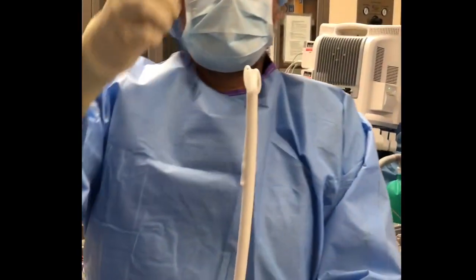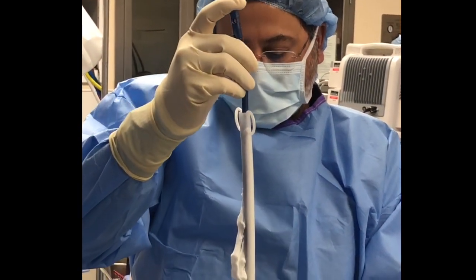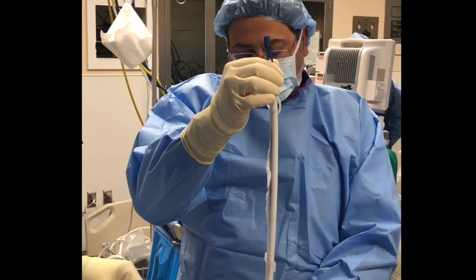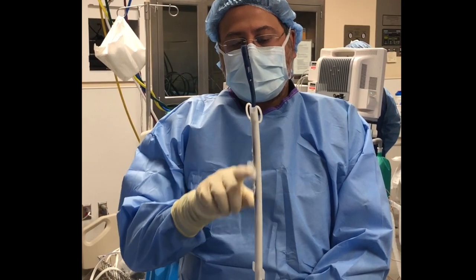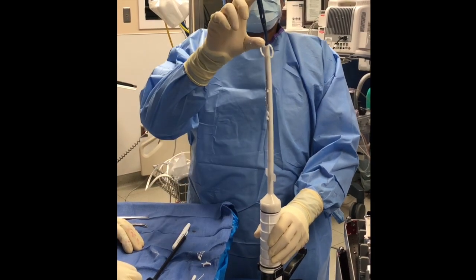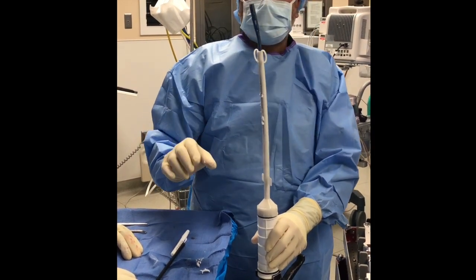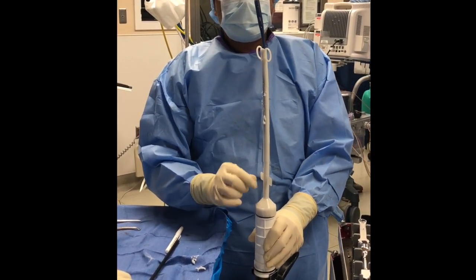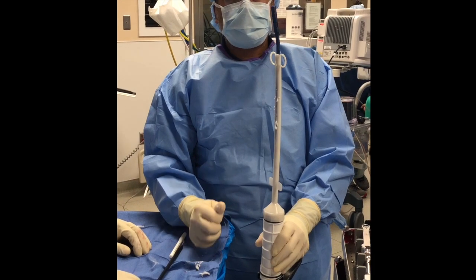This is a pretty long nail, and I'm just going to fire the nail down. It doesn't matter if the cement comes out — that's fine, it has to go somewhere. I'm just going to push it all the way to the end. Try not to push it through into the cap because then you often get a big chunk. We're using an eight millimeter nail, and the tube makes it 11 millimeters. You notice we don't have it on the top — this is a very long nail, a 435. This guy's tibia is gargantuan, so we just have to get the bottom. I don't mind if the cement goes into the holes; I can still lock it. As long as it interdigitates in the holes, we don't have any delamination of the cement from the nail — that's how we prevent delamination.